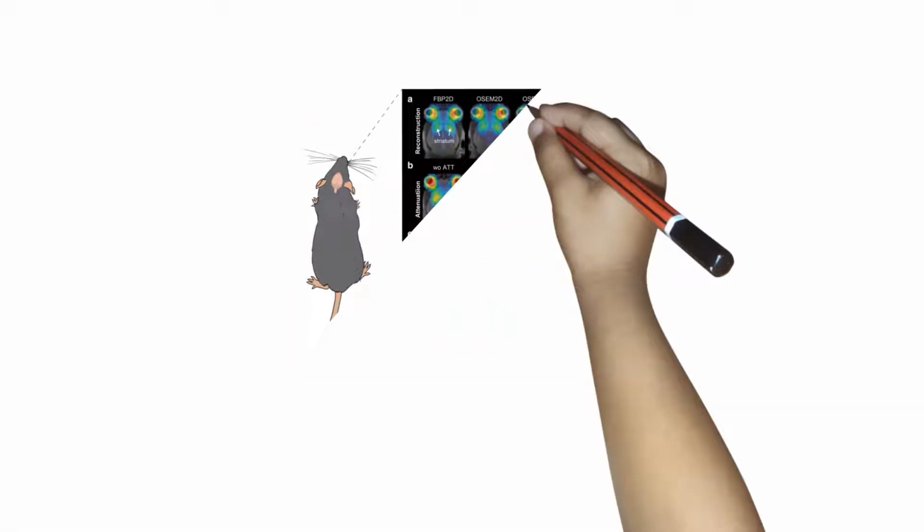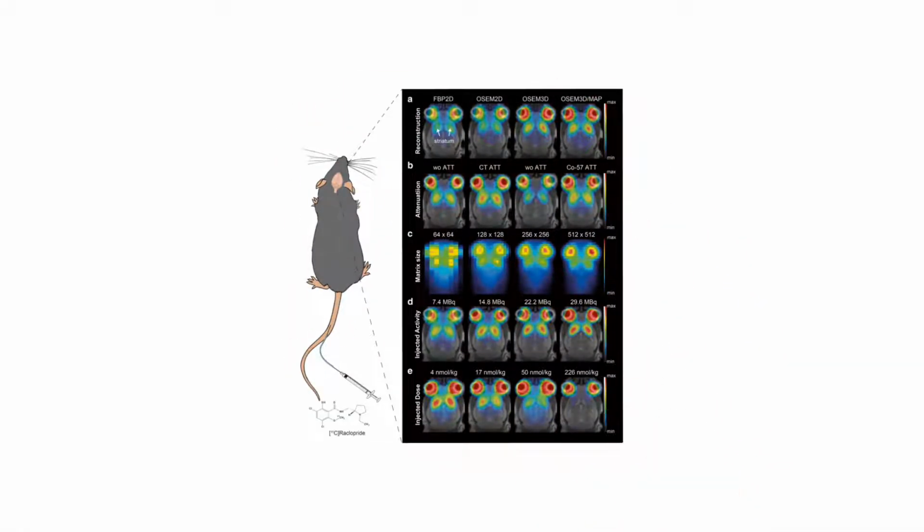So you must have seen this kind of images in research articles. This is in vivo imaging of live animals like mice, rat. You can achieve this by using certain dyes that you can inject via intravenous route, and then you can see the tissue localization of whatever you have injected or whatever you want to see, so in which part of tissues or organs it is deposited.